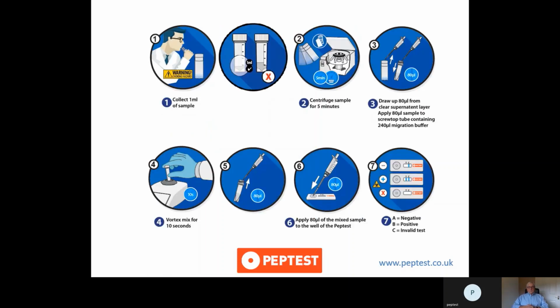This is a very simple description of really how it's done. The first is we ask the patients to spit into a tube. That tube contains a small amount of citric acid. This is to make sure that once the pepsin is collected, it doesn't auto-digest itself. So the citric acid will make sure that doesn't happen, and it can actually be stable for between 5 to 7 days. We then centrifuge these tubes for 5 minutes at 4,000 RPM.